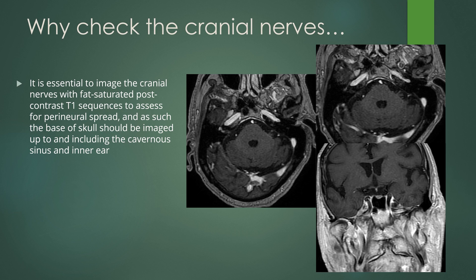When you have a malignant parotid or other salivary gland lesion, it is always important to check the cranial nerves. You look at thin-cut fat-sat post-contrast T1 to look for perineural spread, especially at the skull base, and you should image up to and including the cavernous sinus and inner ear. This shows abnormal enhancement of the right geniculate ganglion and the facial nerve — perineural spread of tumor along the right facial nerve — as well as abnormal enhancement within foramen ovale representing perineural spread through the trigeminal nerve and into the right Meckel's cave.